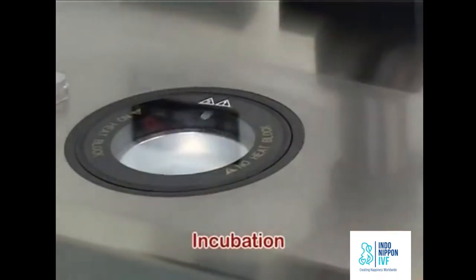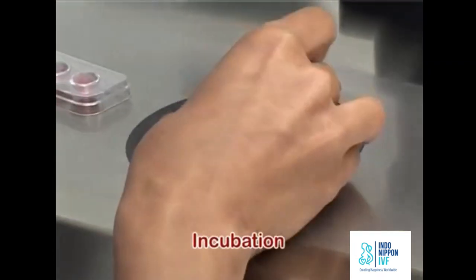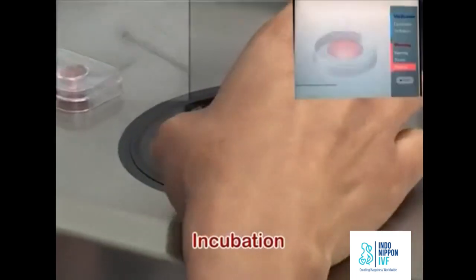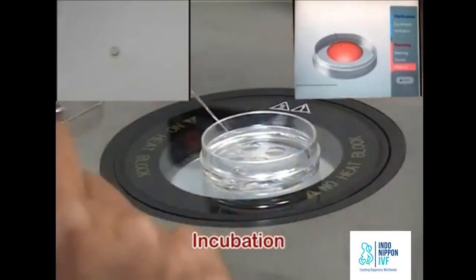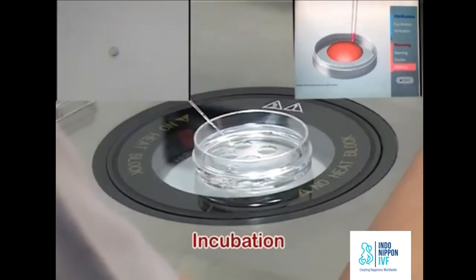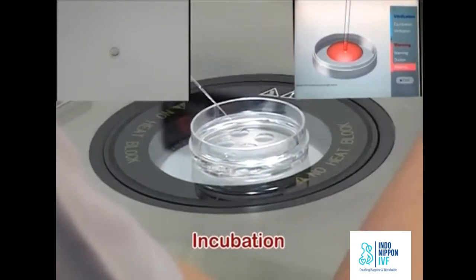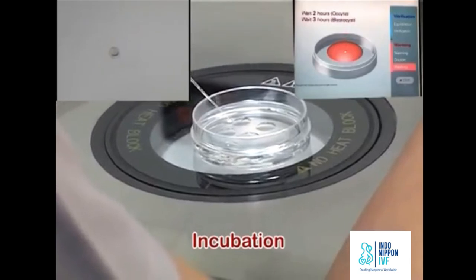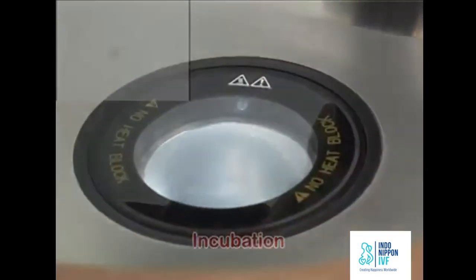Transfer the oocyte in the droplet of the appropriate culture media for recovery. After warming, 4 hours culture for oocyte is recommended as the spindle recovery takes about 3 to 4 hours. So wait for 4 hours after warming before fertilizing the oocyte with ICSI.